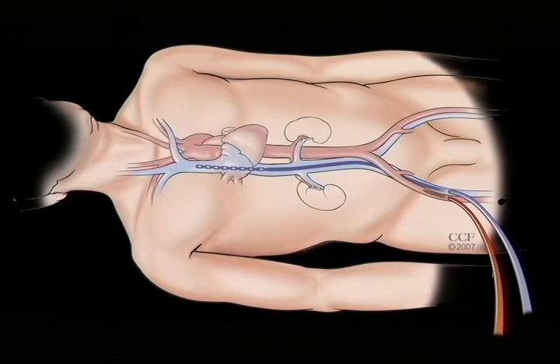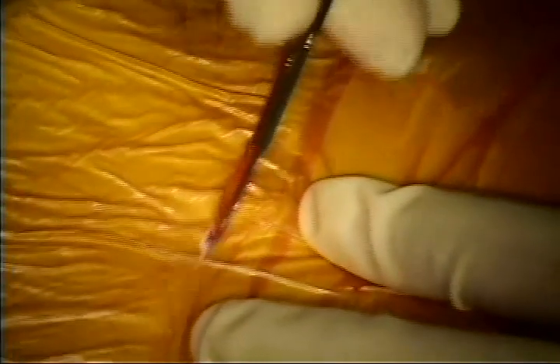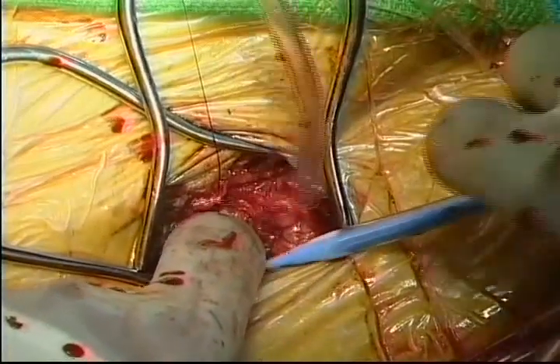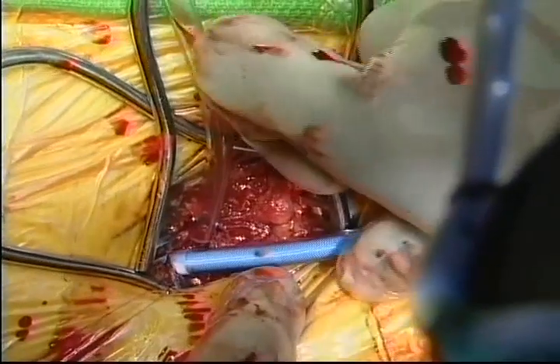With the heart exposed, femoral cannulation is the next step. A single venous cannula will be positioned with echo guidance such that it traverses the right atrium and extends to the superior vena cava. Femoral arterial cannulation is standard. The femoral artery and vein are exposed with a 2-3 cm incision. The femoral arterial cannula is placed through a purse string using guide wire technique.